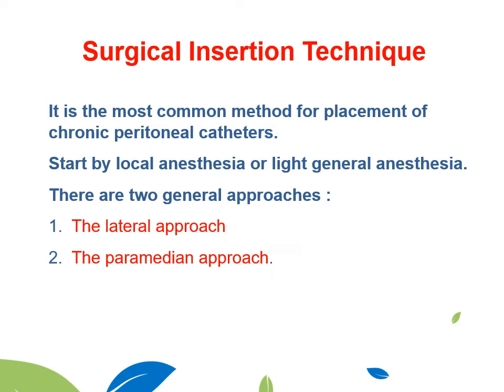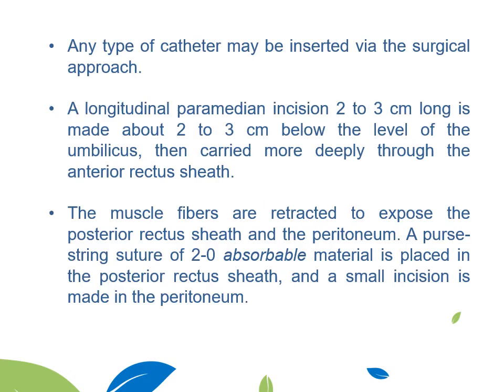For the surgical technique, I will go very fast over some details. Still now, this is the commonest technique used in placement of peritoneal dialysis catheter out of the 3 techniques. It's done by local anesthesia or light general anesthesia. We have 2 approaches, either lateral approach or paramedian approach. Any type of catheter can be inserted via the surgical approach.